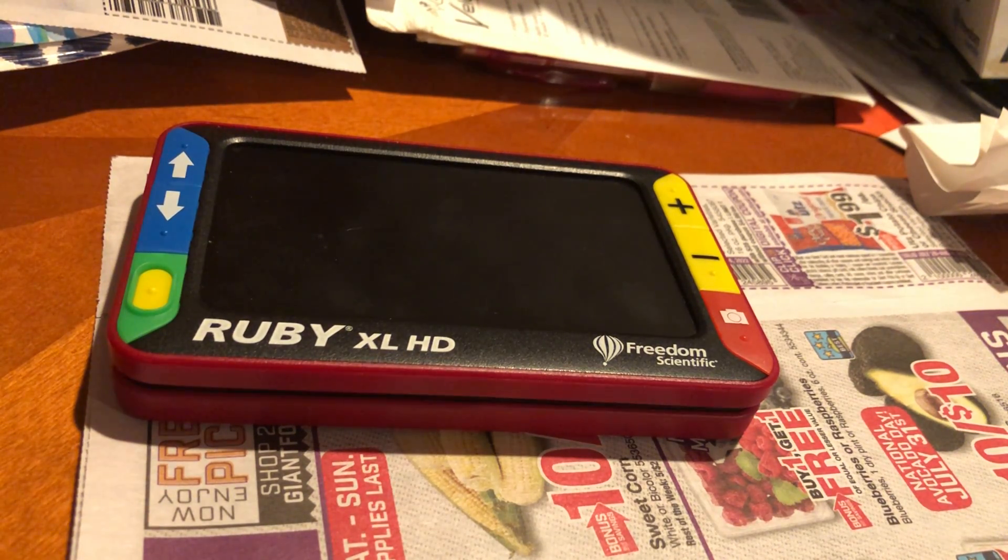This is an overview of the Ruby XL HD Portable Video Magnifier by Freedom Scientific. This Ruby has a 5-inch HD screen and is about the size of an average smartphone.